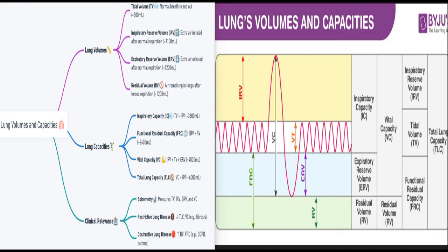Alright, so the key points on the flow volume curve: remember the TLC, total lung capacity, residual volume, and the forced vital capacity. The PEF, peak expiratory flow, is the maximal expiratory flow achieved, and is a measure of the air expelled from the upper airways, that's the trachea and bronchi.